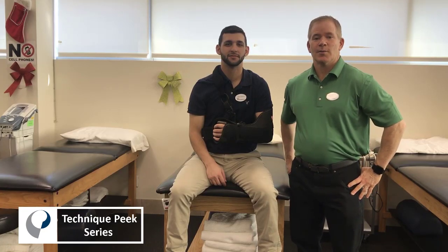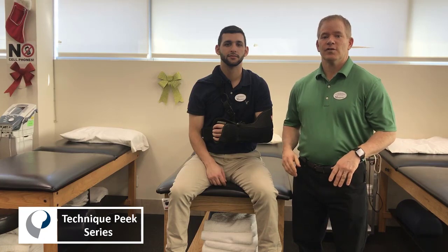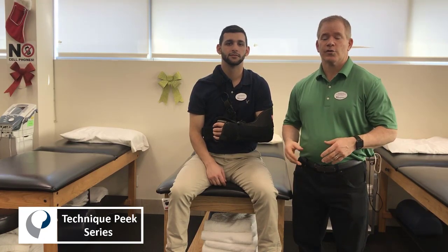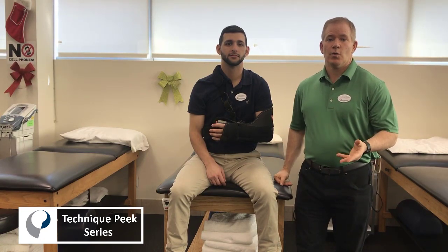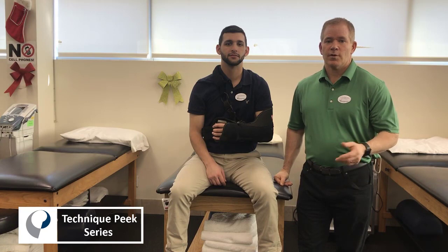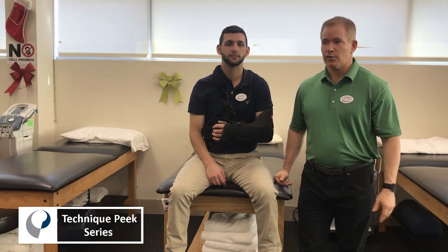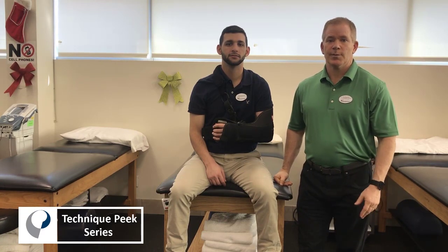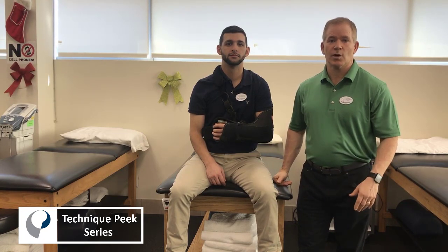Hi everyone, this is Bob McKay from Technique Peak and we are going to go over today how to safely take off a sling following shoulder surgery. Patients often come in and have no idea how to take a sling off — they've not been provided with instructions in the hospital. So we're going to go over that very simple but useful tip, especially on day one when the patient comes in following, for example, a rotator cuff repair.